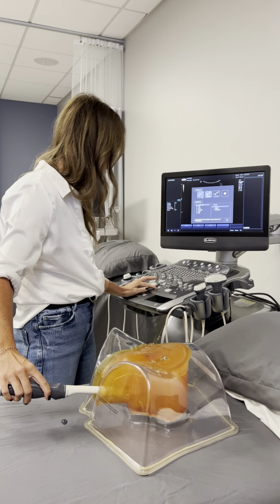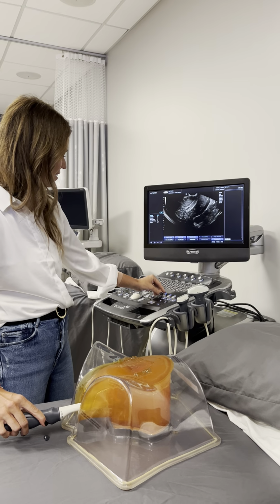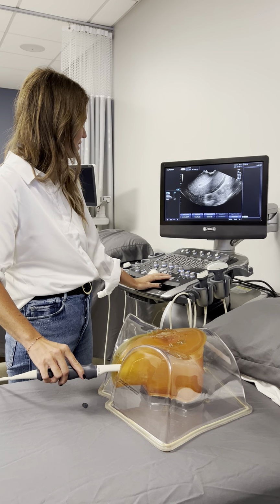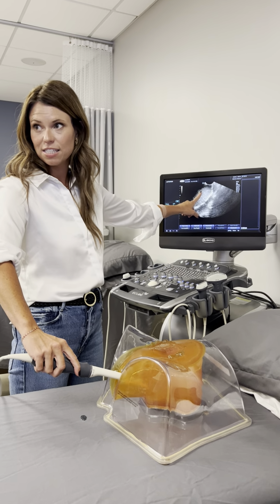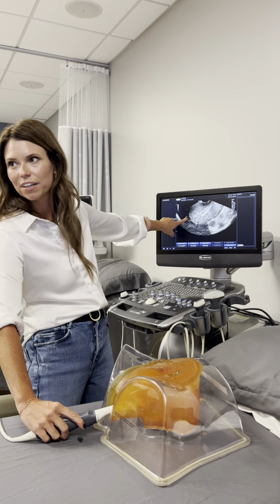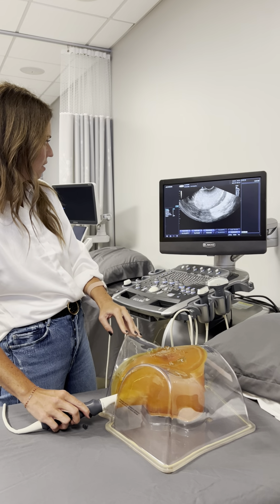So you're going to go to your settings here, and look at how much clearer she is. Now we can really see her endometrium, right? So we are scanning this. As you go up, you're looking more at the cervix, this is in an anteverted uterus, right? As I go down, I'm looking more at the fundal area. And I think that was a test question too, right? So up towards the cervix, down towards the fundus.